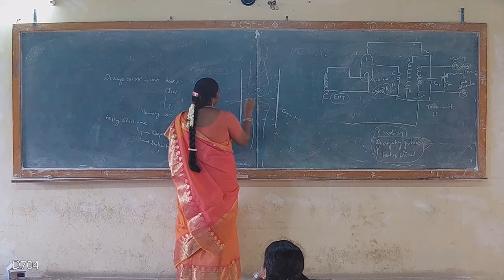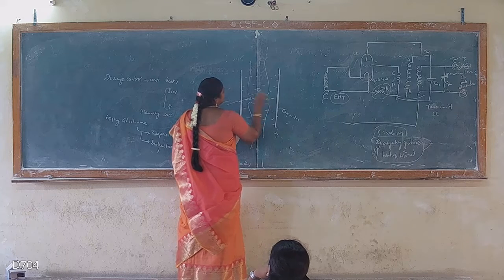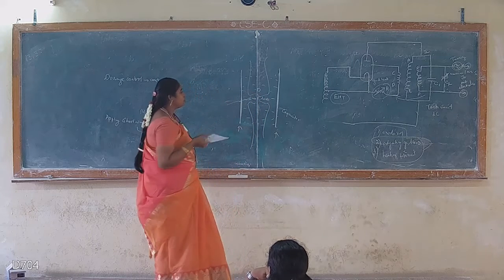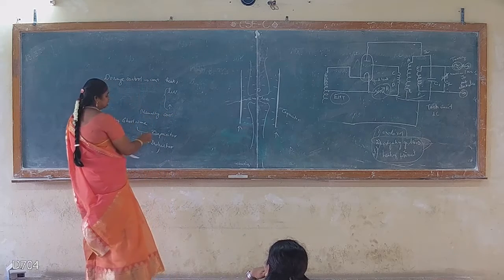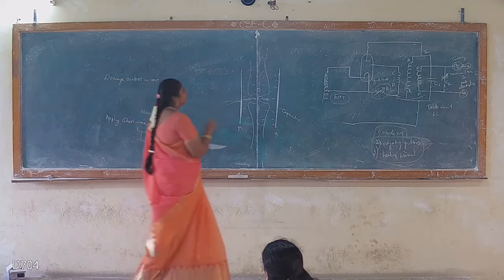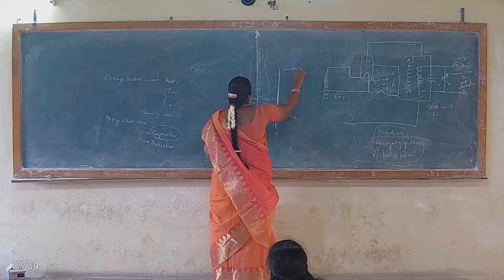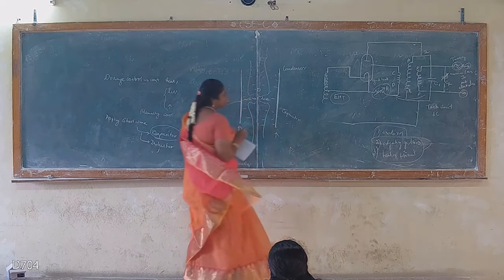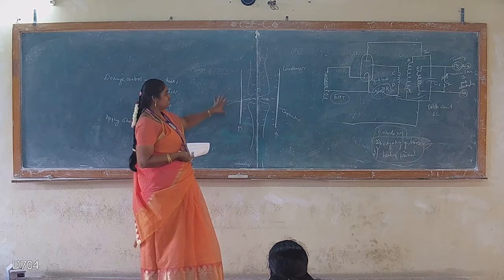The dielectric loss here is applied as heat to the particular area. That is why this method is called the capacitance method, or otherwise the condenser method. In the condenser method, we can also place the electrodes side by side.